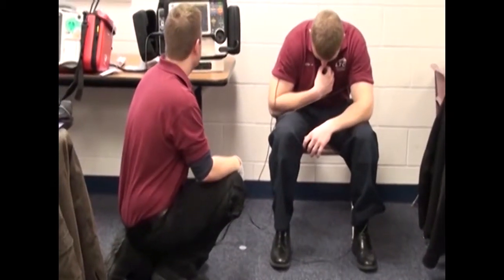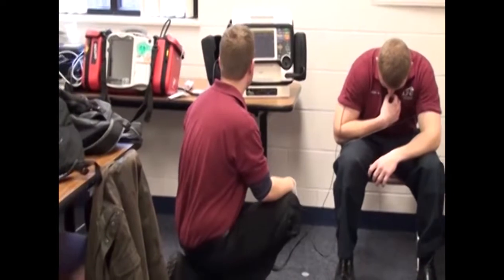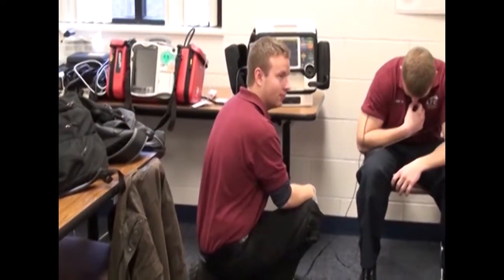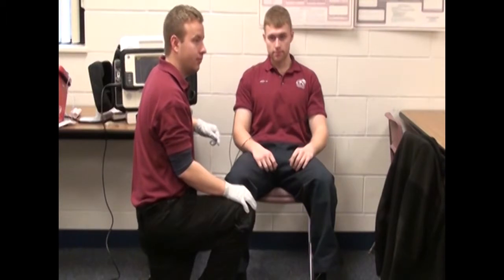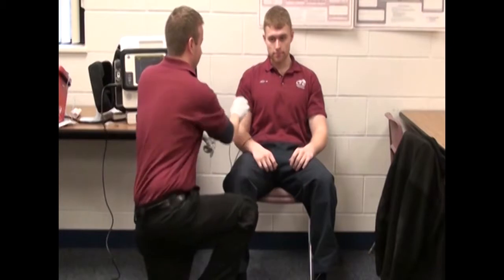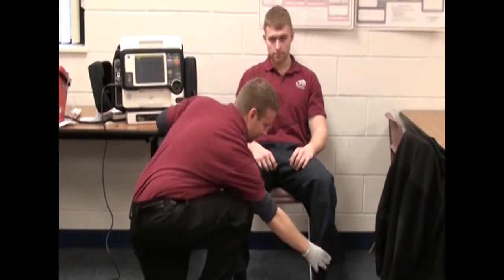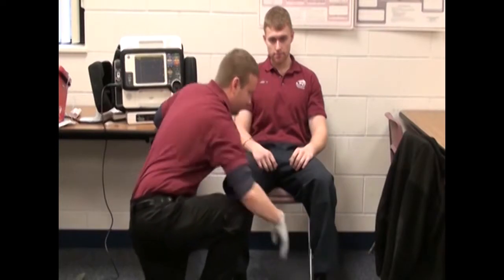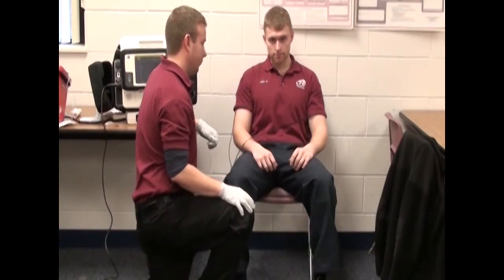Running a strip — typically with the leads in the place that they're in, you can run a strip from leads one, two, and three. The different leads it looks at: lead one is right arm to left arm, lead two goes across, and lead three goes from left arm to left leg. This skill is completed. Thank you.